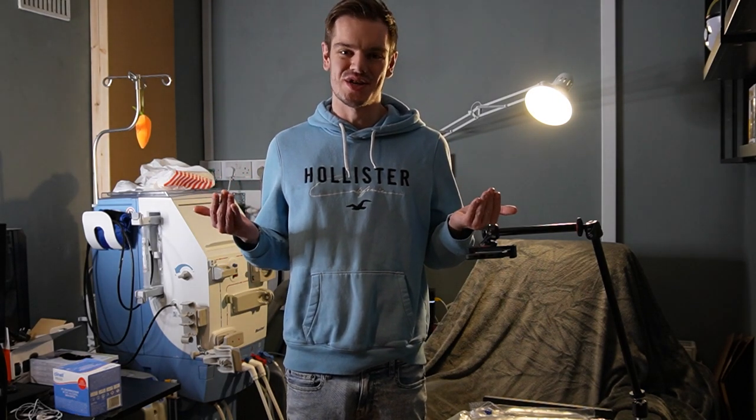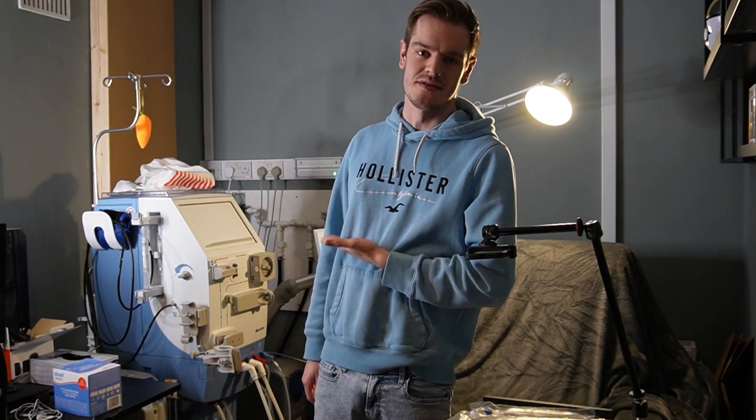Hey guys, how are we all doing? Welcome back to the channel. Yes, it's been a long break again, I'm so sorry, but today I'm going to show you what life's like on dialysis at home.